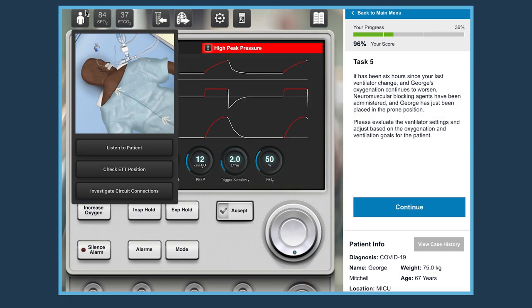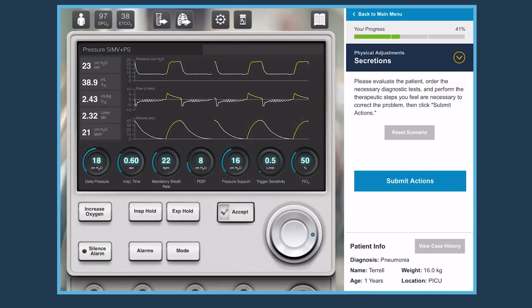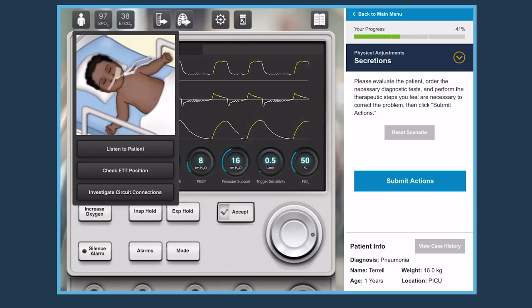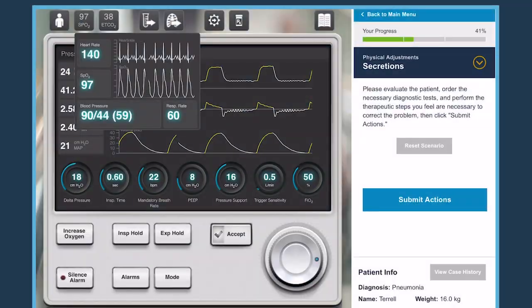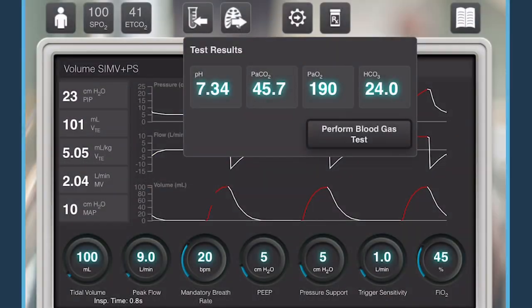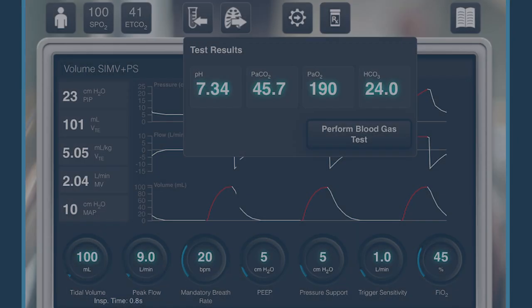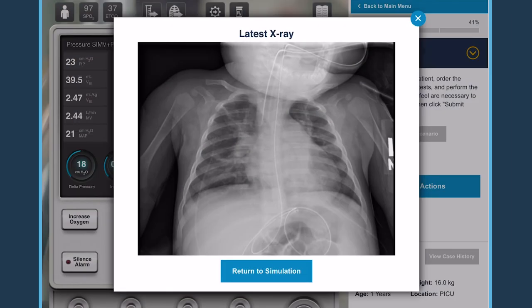The Virtual Ventilator incorporates real-time changes in ventilatory parameters, patient appearance, vital signs, arterial blood gases, chest x-rays, and more.